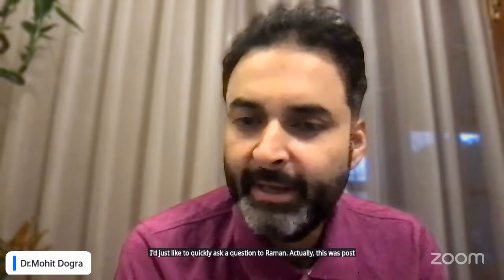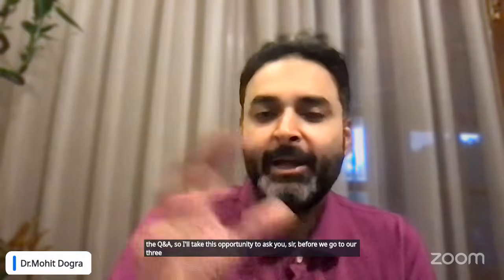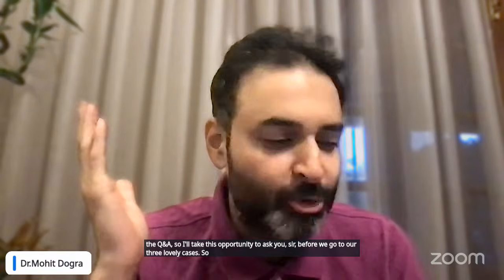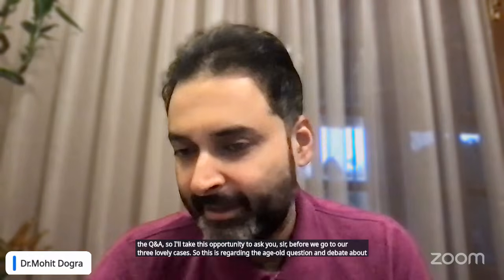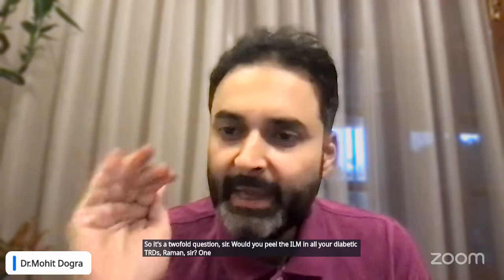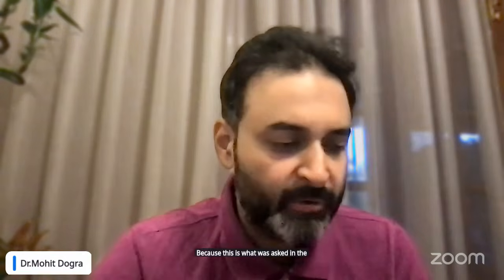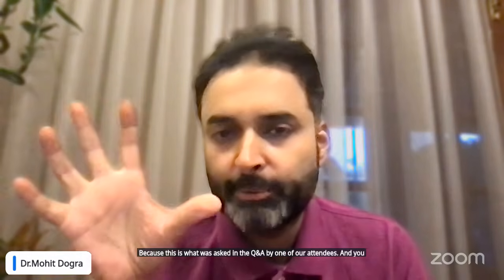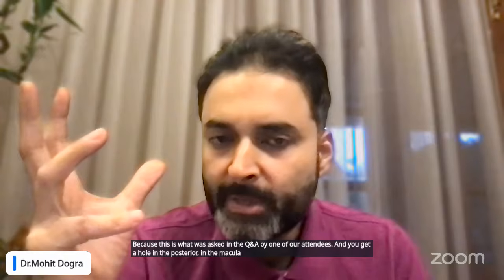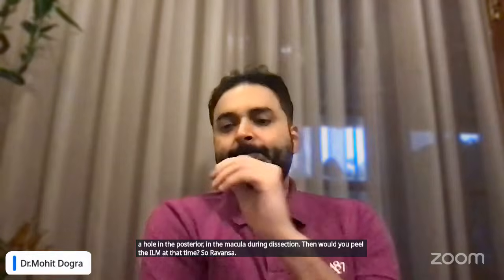I'd just like to quickly ask a question to Raman sir. Actually, this was posted in the Q&A, so I'll take this opportunity to ask you, sir, before we go to our 3 lovely cases. This is regarding the age-old question and debate about ILM peel in diabetic TRD. It's a twofold question. Would you peel the ILM in all your diabetic TRDs, Raman sir? And 2, if there is no macular hole, and you get a hole in the posterior macula during dissection, then would you peel the ILM at that time? What would be your take on that?